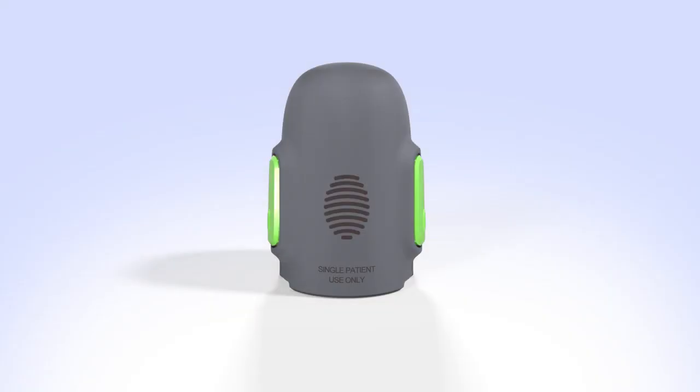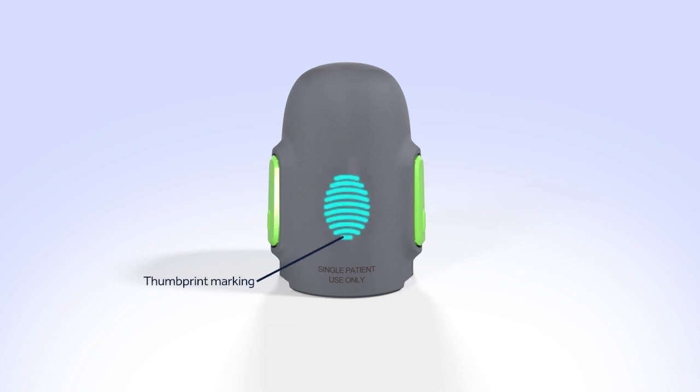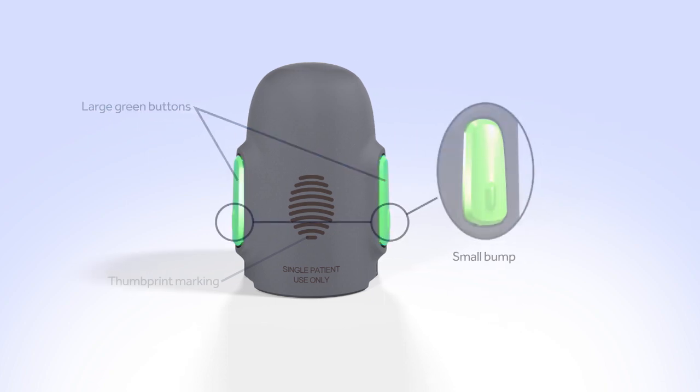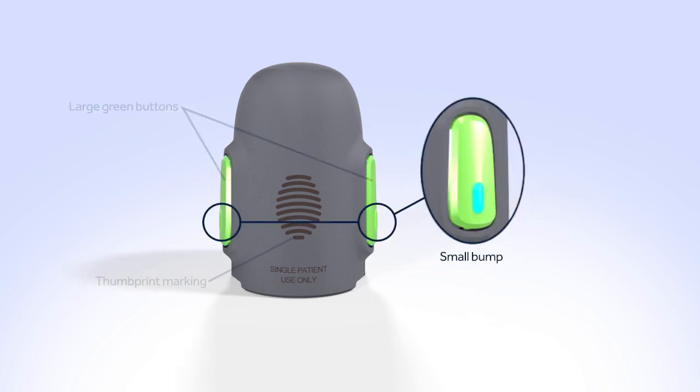Now let's take a look at the serter. The serter has a thumbprint marking on one side, where you will hold the serter while loading the sensor. On either side of the serter are two large green buttons. To insert the sensor into your body, you will place your thumb and forefinger on the small bumps on these buttons and press once.